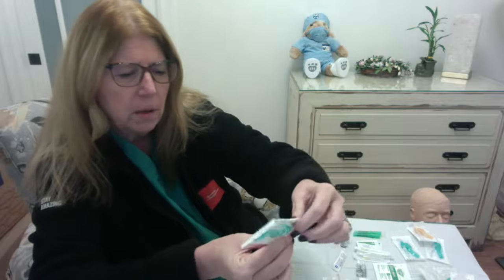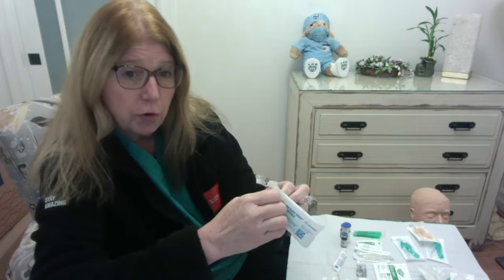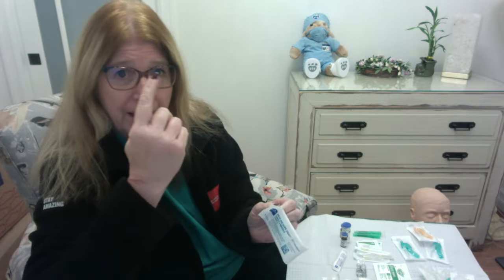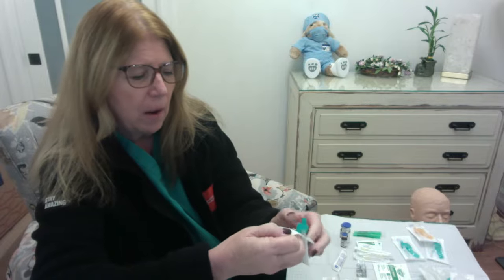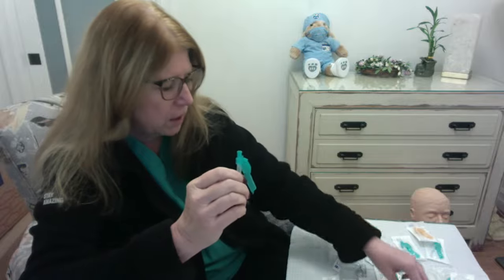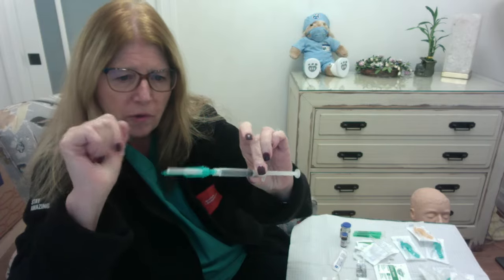And this particular needle is a 21 gauge needle by 1.5 inches. So this is a larger size needle. When we talk about those gauge numbers, remember that the higher the number, the smaller the gauge or the diameter of the needle. So if we would open up this package, when we take this out, we want to be sure not to touch the hub. Again, this is the sterile portion of the needle. So if we're going to put these two pieces together, we're not touching this and we're not touching this. And they go on with just a simple twist, okay?